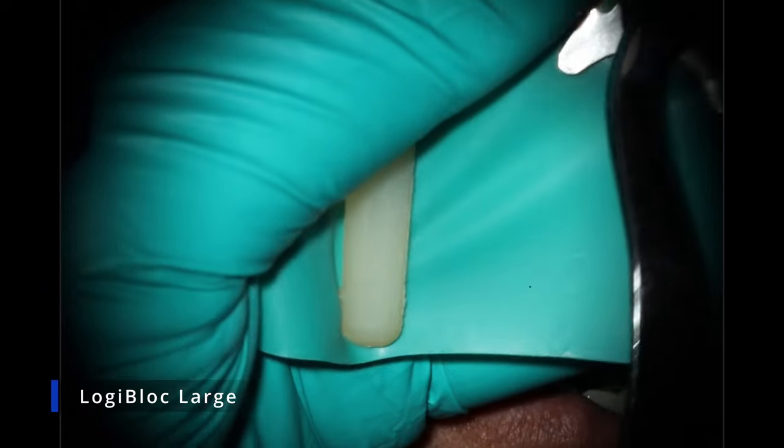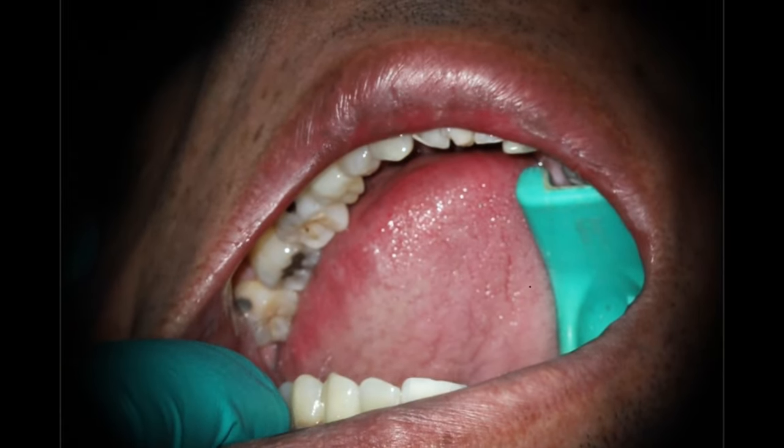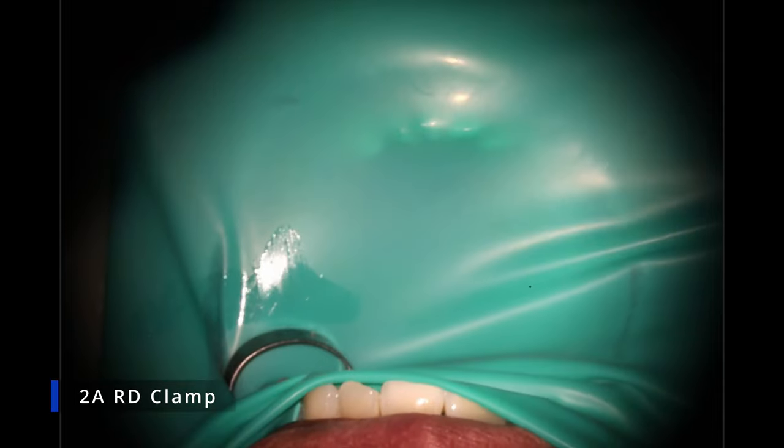Showing you how the case starts. We use these Logic bite blocks — they are way more comfortable than the traditional ones because they have that cutout in them, so there's a little more space for the tongue. Patients really like that. Just doing single tooth isolation here because we're going to be making a very small hole through the top of it.